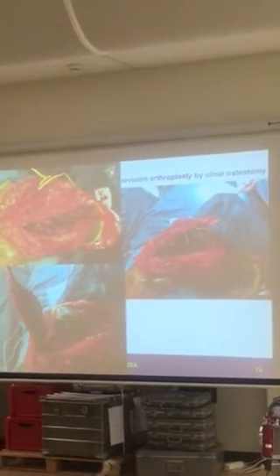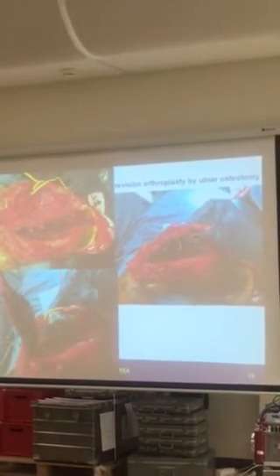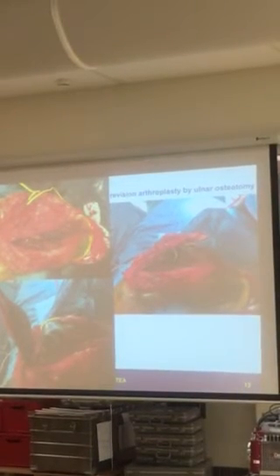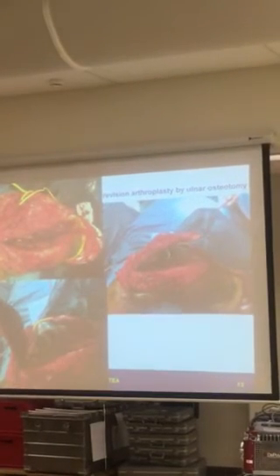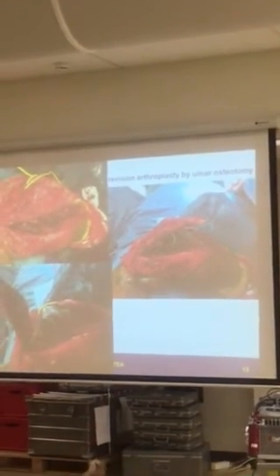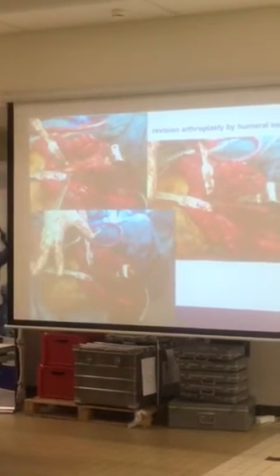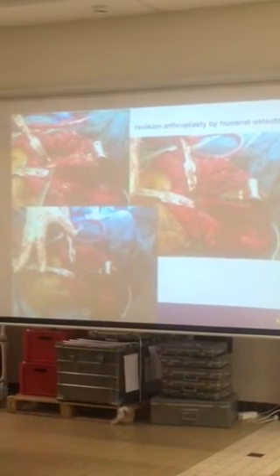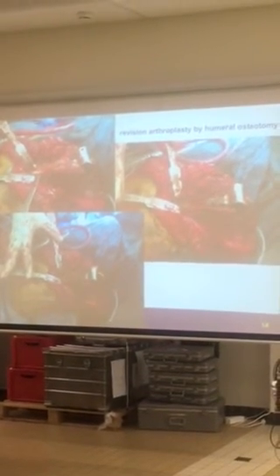To give you a little bit more, we are now also using this triceps-on approach for revision arthroplasty. It is a little bit beyond the scope of this course, but I want to show you the extended possibilities of the approach. If you do an ulnar osteotomy, we can reflect the triceps on with the ulna, and we get a complete view on the prosthesis which has to be removed. So it's much easier to get the cement out. On the other side, when everything is gone, the triceps is reflected. The triceps is lying here around the Hohmann retractor, and we can also do an osteotomy of the distal humerus and then take out the prosthesis here. So this is an extension.